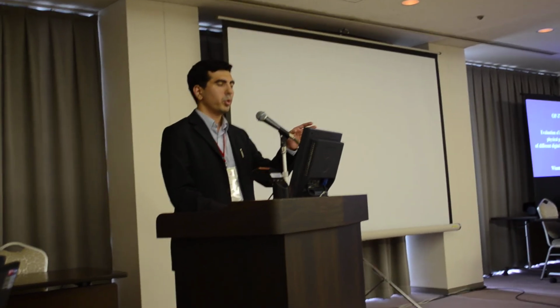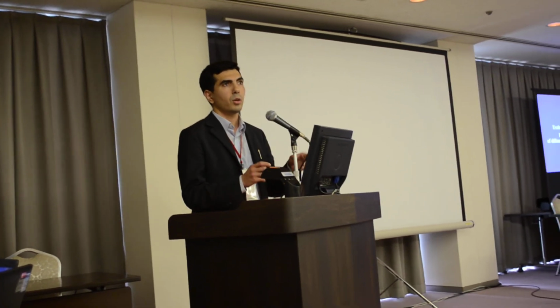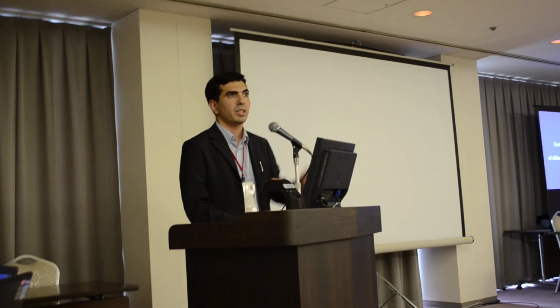But how about the comparative sensitivity of the different sensors? We included that. We had the signal to noise ratio phantom, and we took exposure times from 0.01 to 0.2 seconds. We plan to do a signal to noise ratio analysis, and hopefully we will be able to get a plot or a graph showing us the different sensitivity of the sensors. Yes. Thank you.